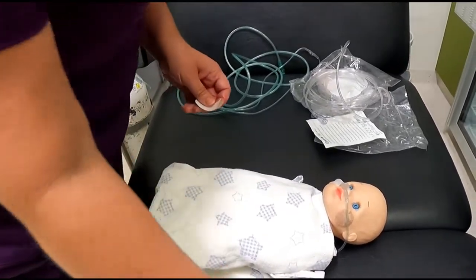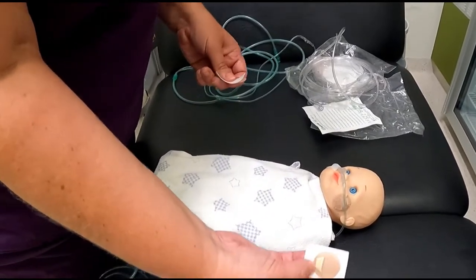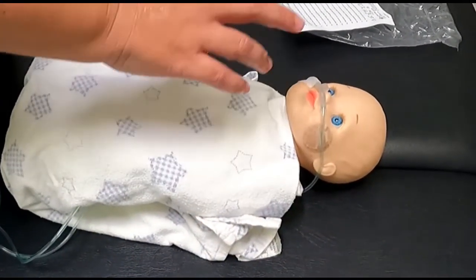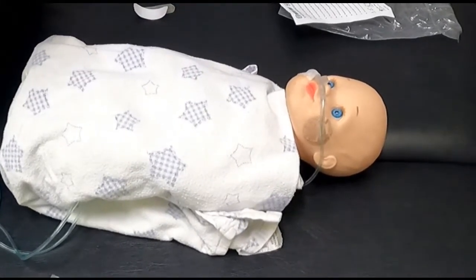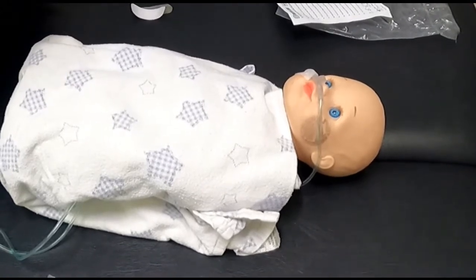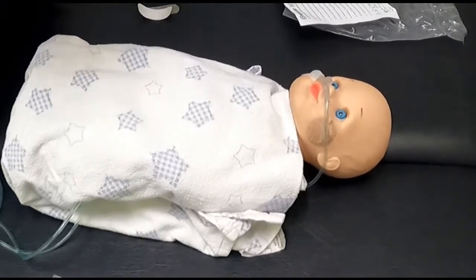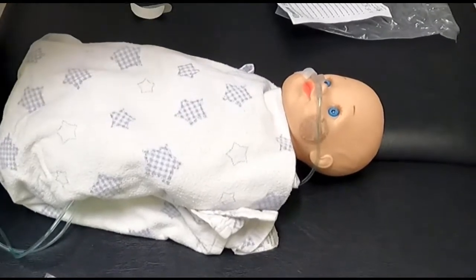I'm also going to demonstrate how to use tender grips. It's just another way of taping that a lot of our families really like. Now you'll find by 7 days, the tapes are pretty much ready to come off. There's all sorts of adhesive removers and things that you can buy to take the tapes off, but they're quite smelly and quite oily, so you really have to make sure that you've wiped the remnants of them off before you put your new tapes on. I find that just a wet soapy face washer is just as effective.